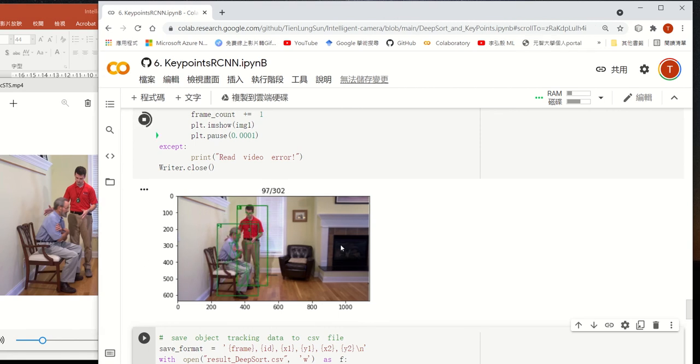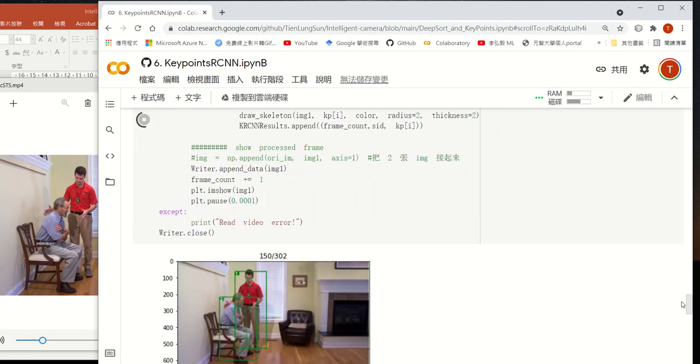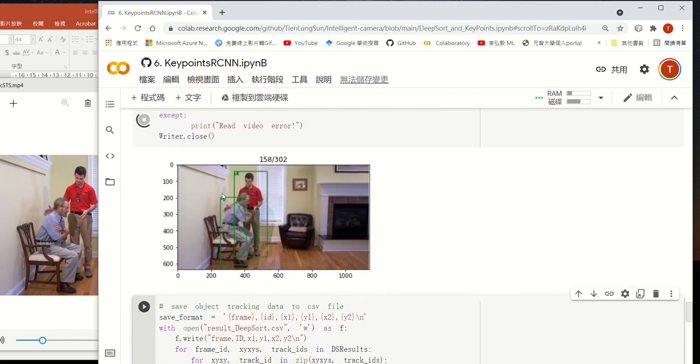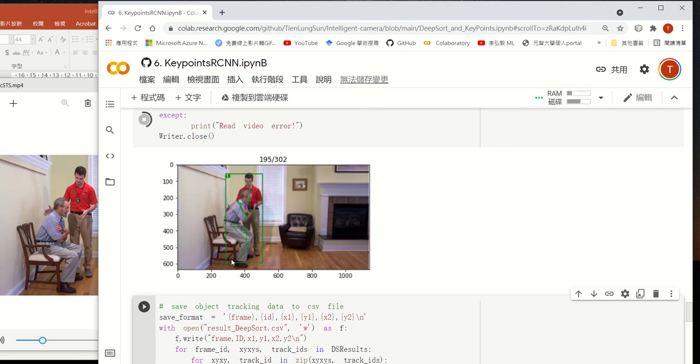At this moment, just let me know when the label changes. I need to figure out how to fix this bug. As you can see, now it changed to label 1. Although DeepSort can let us track the subject ID, the program we downloaded from PayZQ's DeepSort is not very stable. So if possible, have just 1 subject in your video. If this elderly needs some assistant to stand behind to take care, we hope that DeepSort can help us identify the subjects. Here, as you can see, it keeps changing again.